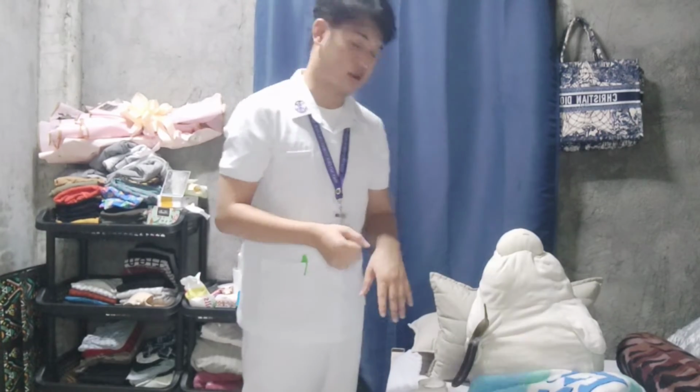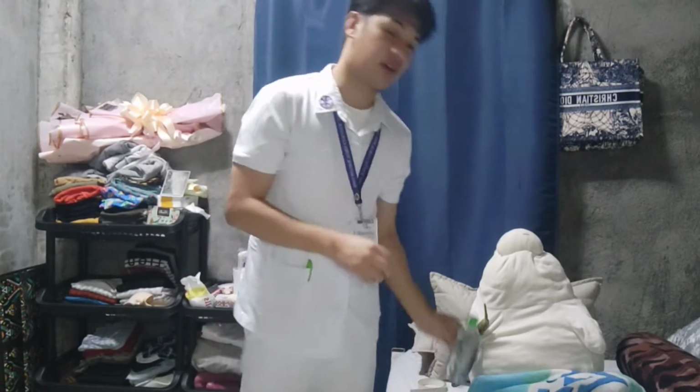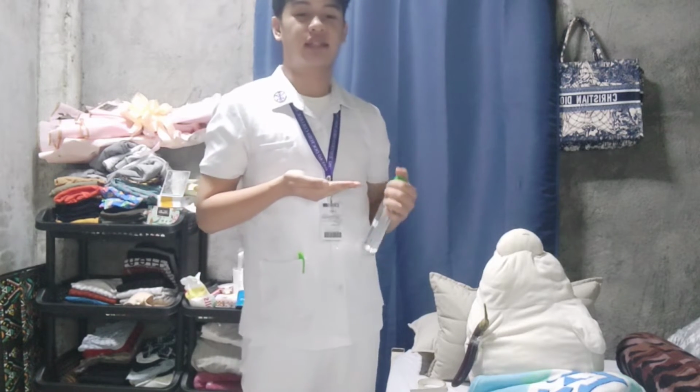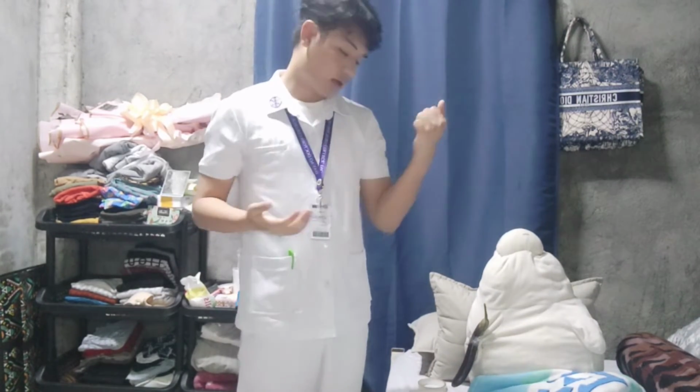So, next is we need to perform hand hygiene and observe other infection prevention procedures. This is to deter the spread of microorganisms. So, we need to perform hand hygiene again. We have here the antiseptic, alcohol. Next is we need to prepare the medication from the ampule or vial for drug withdrawal. I've already done that. I've just prepared the medication.